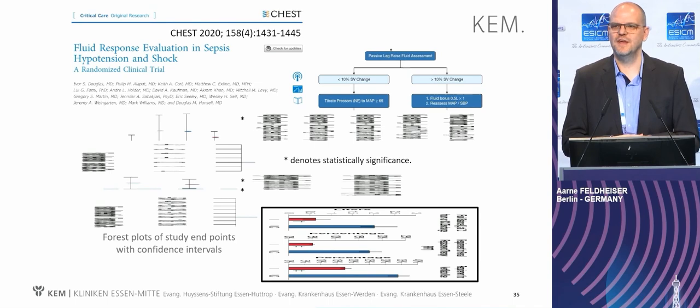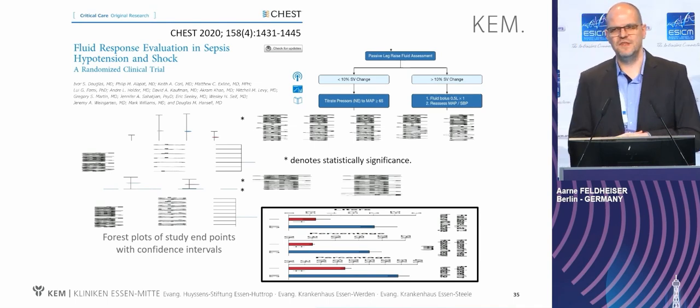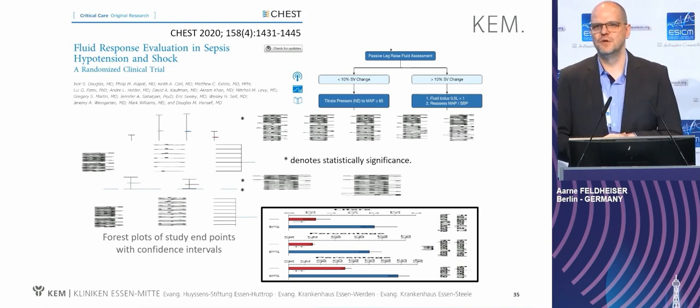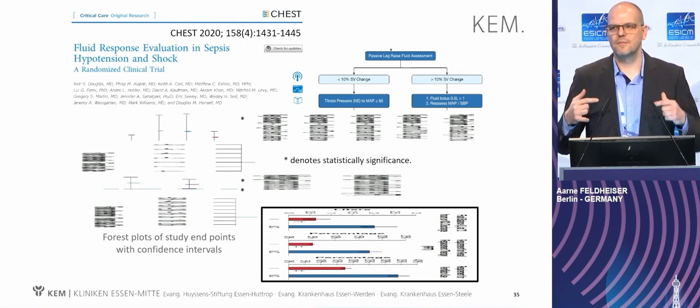The primary outcome was positive. There was a reduction in fluid administered in the first 72 hours. And additionally, they could reduce the number of renal replacement therapy in this trial by administering the fluid guided based on that monitoring device.